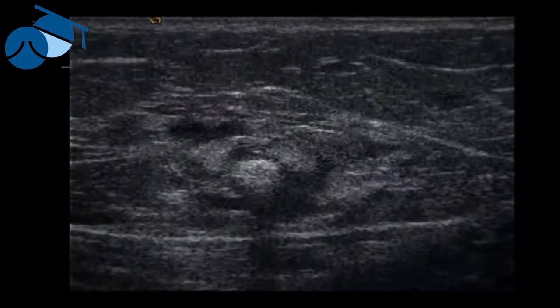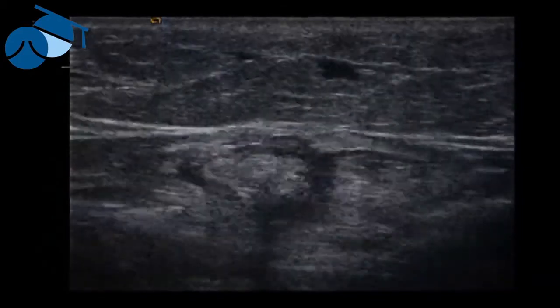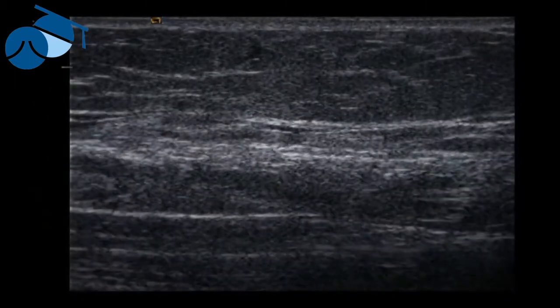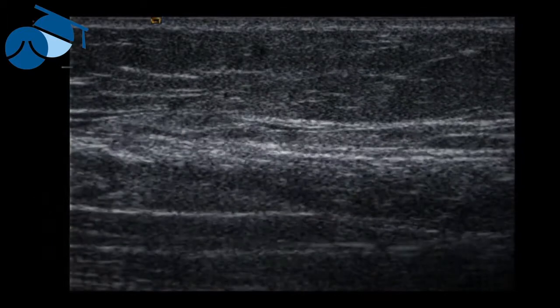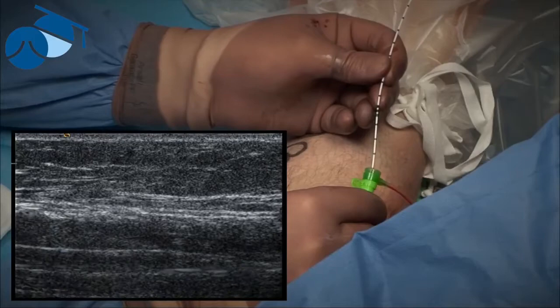and that when it's being pushed on, there's absolutely no give in the wall at all, so it's rock hard at the moment. And then in longitudinal section, you can see now there's gas bubbles within it, and the whole thing looks completely and utterly destroyed. So that's exactly what we'd expect to see at this stage.